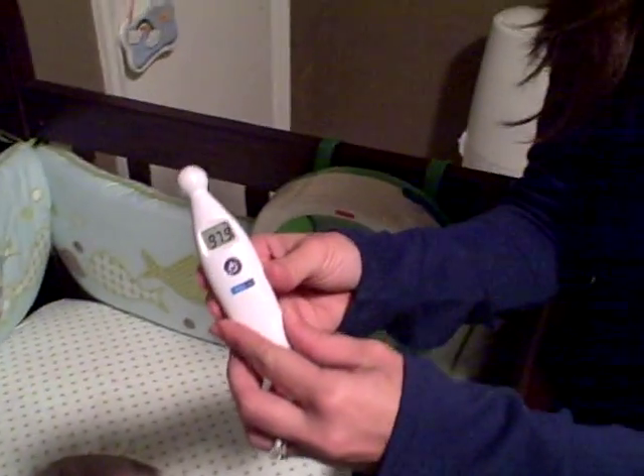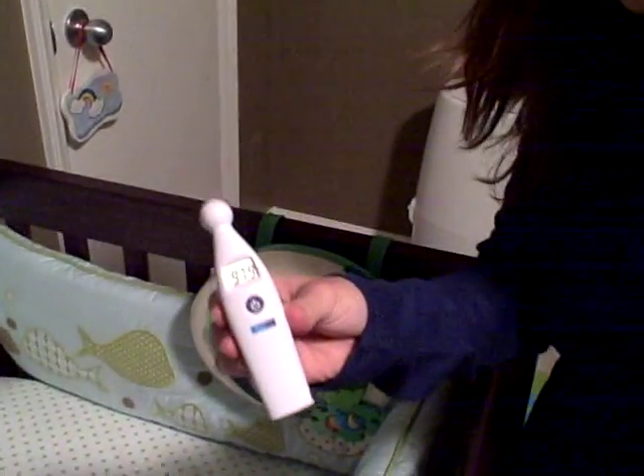Now we have our results. The baby is still sleeping. To turn the device off, you just hold down the power button. And if for any reason you wanted to take the temperature again, just wait about two minutes so that you let the device reset.